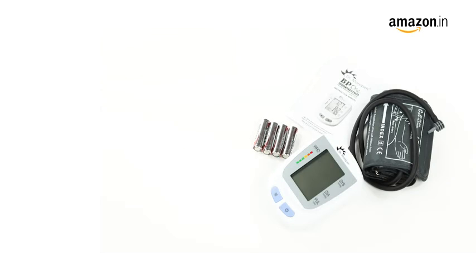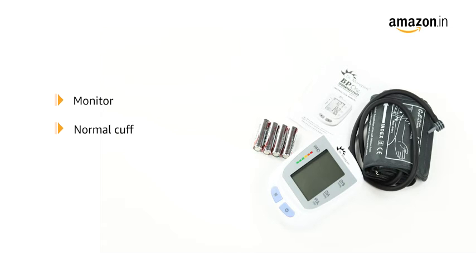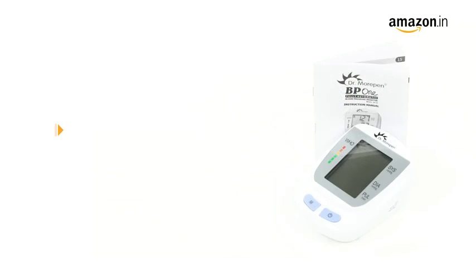In the box, you will find the monitor, one normal cuff, four AA batteries and the user manual.